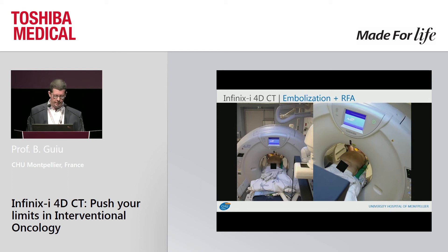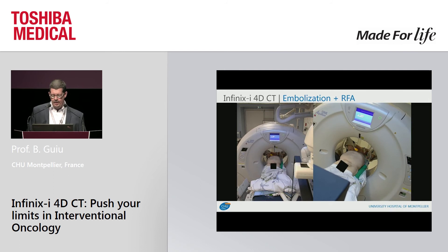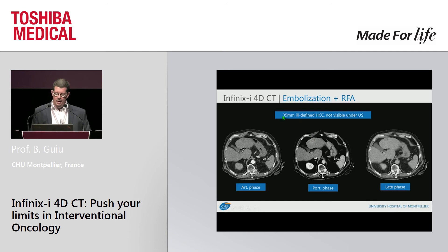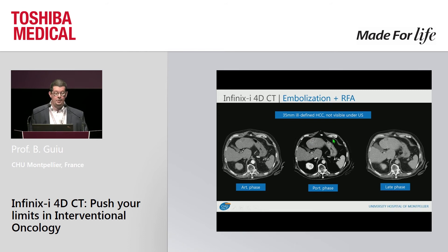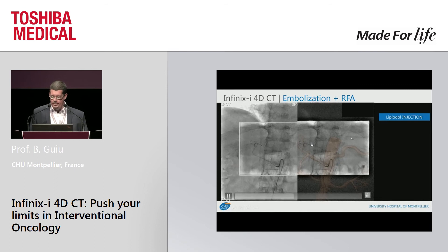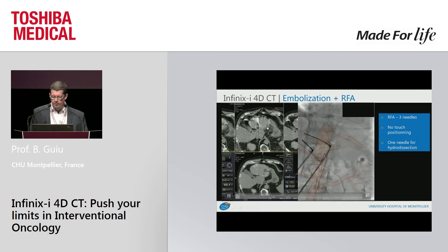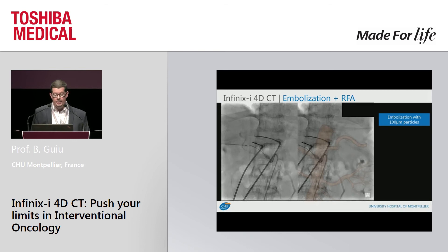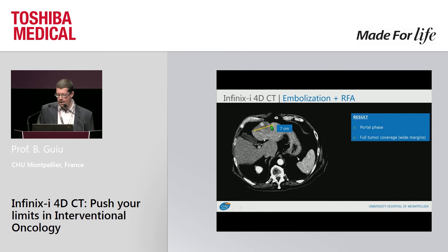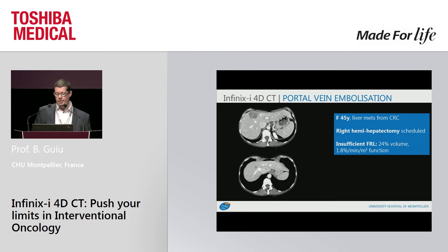Another case: a patient with HCC for a combined procedure — embolization plus radiofrequency ablation. First, a CT scan acquisition for treatment planning. Look at this tumor: subcapsular location, 35 mm, not well defined, and surprisingly not visible on ultrasound. We used 3D road mapping again. We injected a small amount of Lipiodol to make the tumor visible on CT. Then we used CT fluoroscopy to introduce three radiofrequency ablation needles using a no-touch approach, plus a fourth needle for hydrodissection to protect the stomach. We then injected small particles to embolize the feeders and performed ablation — final result showing the tumor with wide seven-centimeter ablation zone margins.